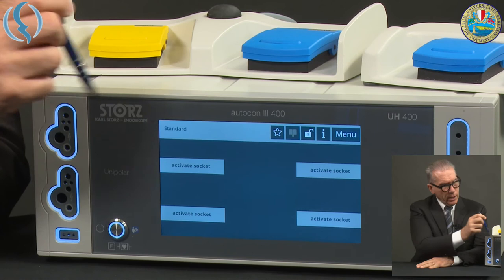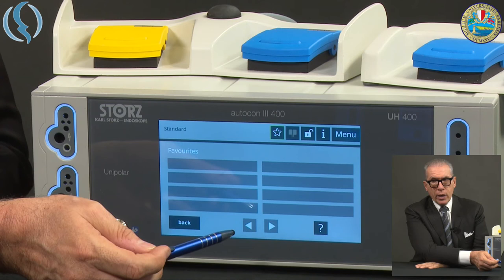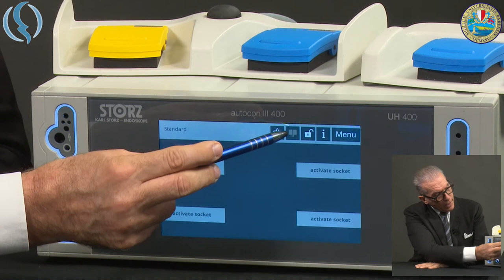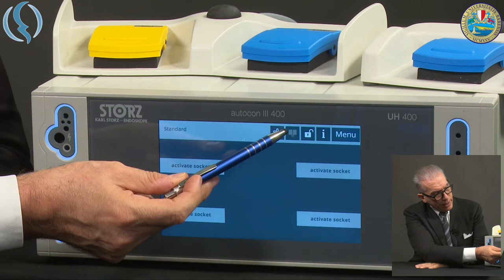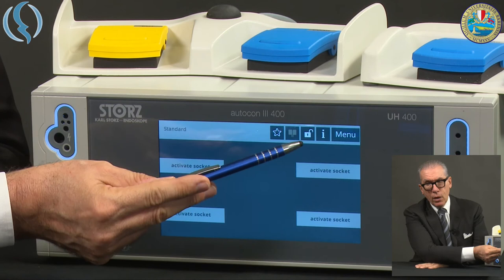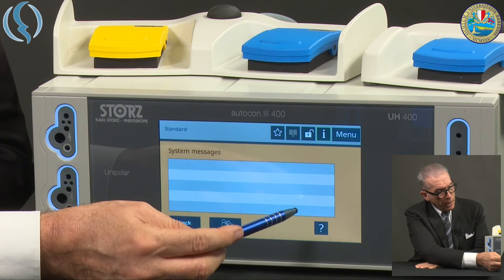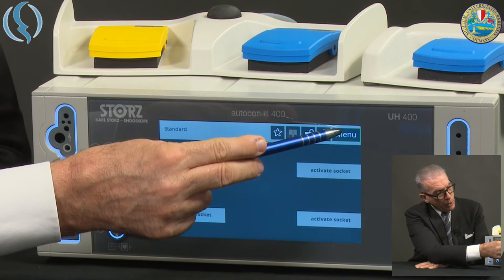Let's have a look now at the main screen, which is a touchscreen. On the upper part we see first of all a star — if you push the star, we have the favorite programs we can choose by getting into the menu, as I will show you later. Then we have a symbol that indicates if the neutral plate is connected. The lock here is open, meaning we can modify settings; if we push it, it goes into lock mode. There is also a high-alert information icon — any problem with the machine would be reported here. And finally, the menu.